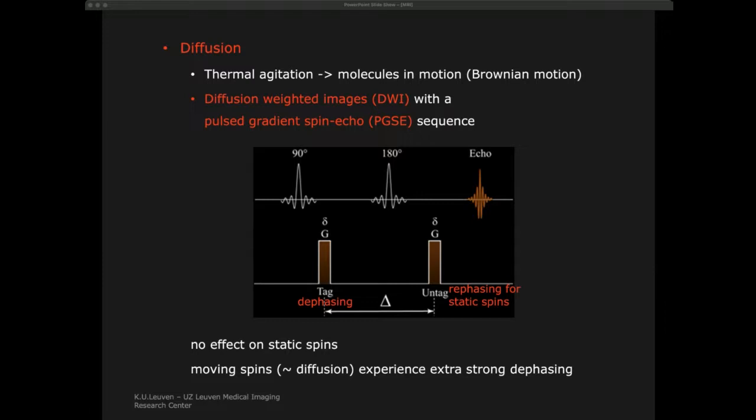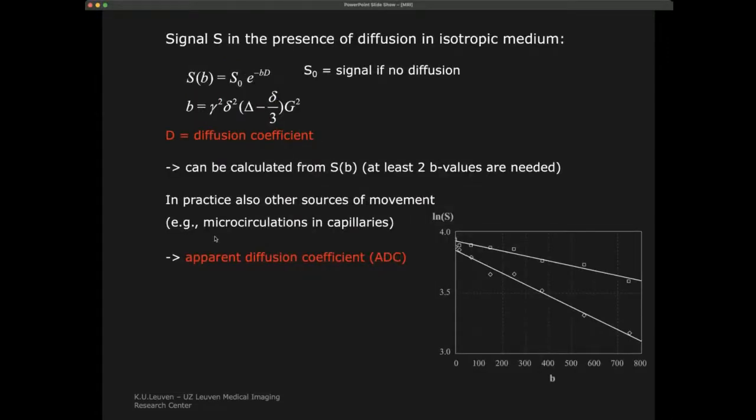That means you have very slow motion of protons, of water molecules, within tissues. We can specifically target these very slow velocities in very similar ways, and by looking at slow velocities, we can try to look at the effect of diffusion. And then we can try to measure local differences in diffusion. By doing different acquisitions, we can look at where we have fast diffusion, or in which direction we have differential diffusion.